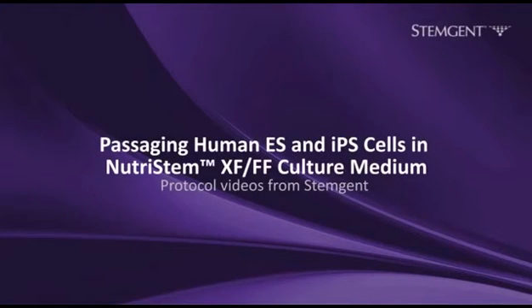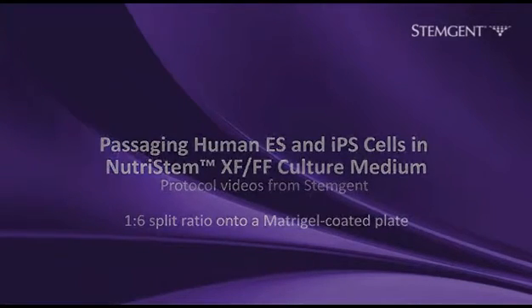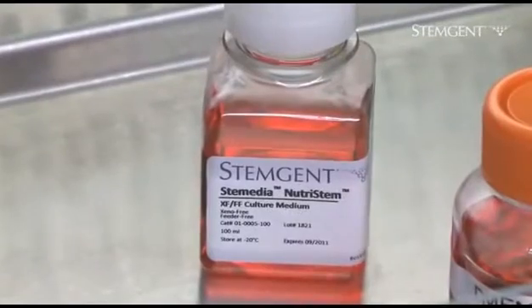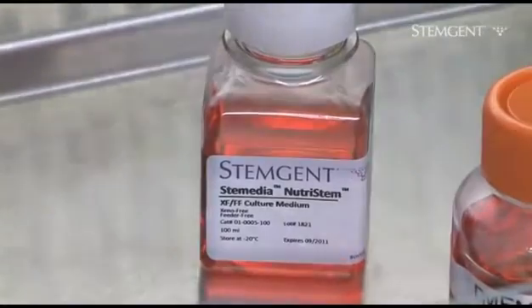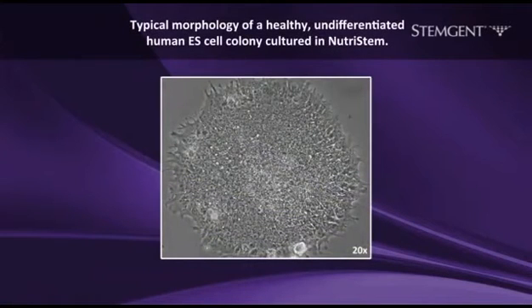Passaging Human Embryonic Stem Cells in StemGen's NutriStem Xenofree Feeder-Free Media. This protocol video outlines how to passage one well of human ES cells at a 1 to 6 split ratio onto a prepared Matrigel coated plate. Although a 1 to 6 split ratio is common when culturing in NutriStem, cells often require a different split ratio at each passage. The appropriate ratio is determined by observing the culture density and growth rate after each passage.